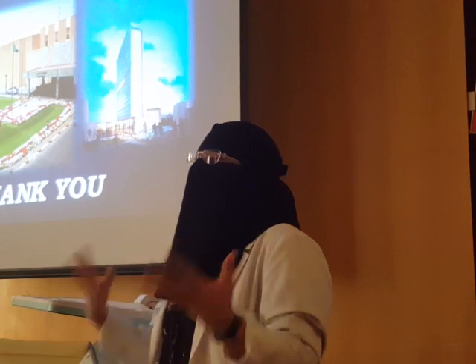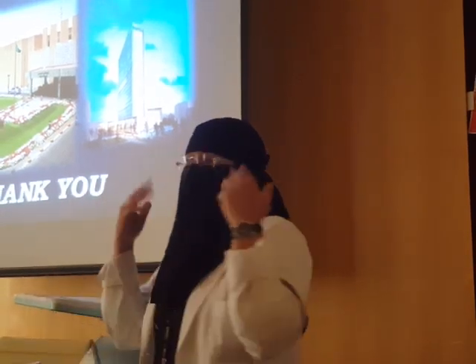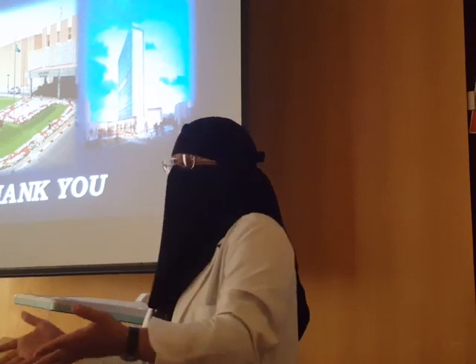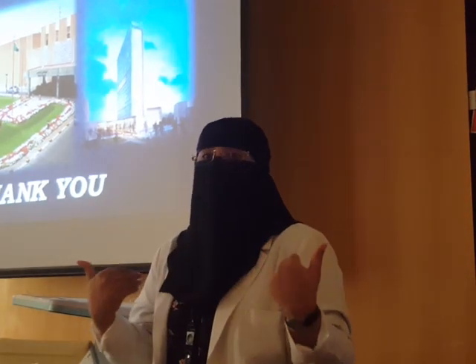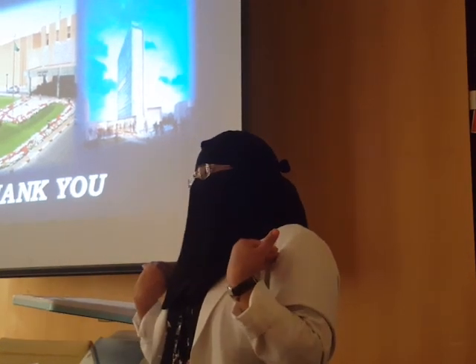يعني we are the one. Everything depends on us. The good information, the good quality, most of the image depends on us because I am the one who is scanning, not the doctor. The doctor will take the information I collect for them.